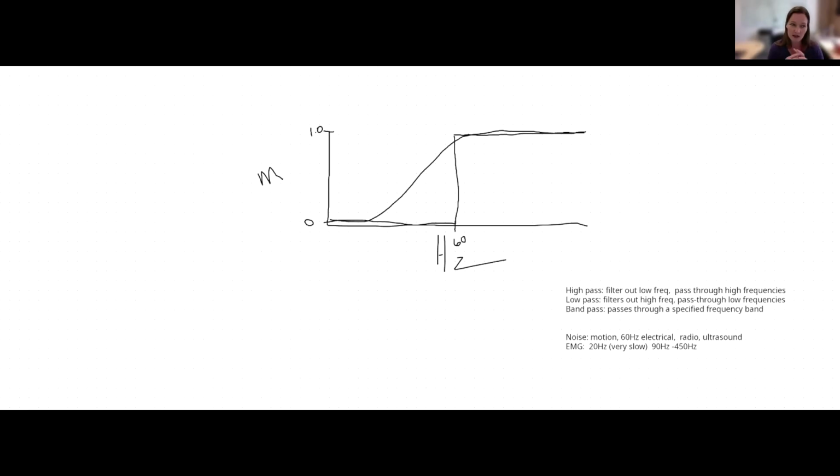But there's a trade-off because as you get filter orders of higher and higher order, it tends to introduce artifacts into your filtered signal. So you can get weird things like, if you might be filtering a force signal that goes from 0 up to a peak and then back down to 0, and you have a really high filter order that's trying to approximate things with too high an order of filter, it might do something like this to your data where it adds some weird artifacts in there.